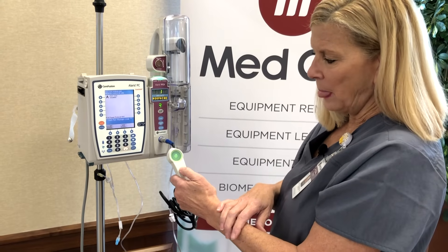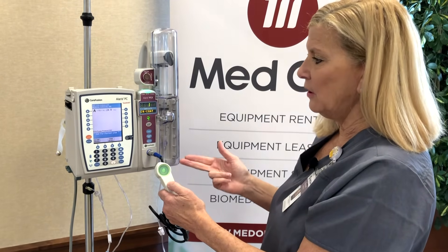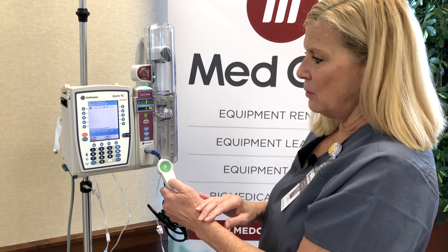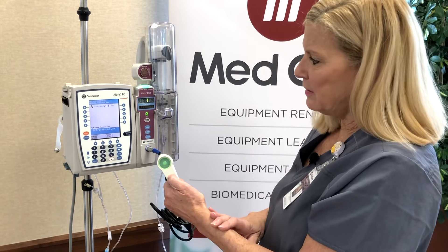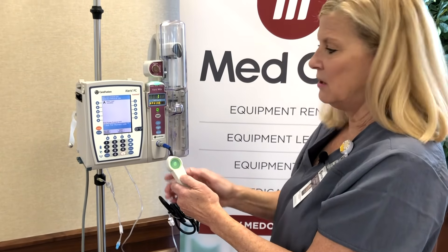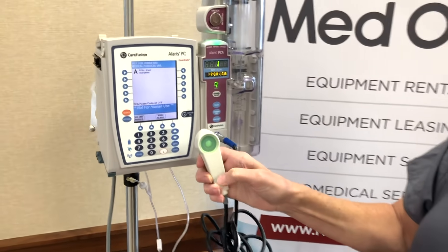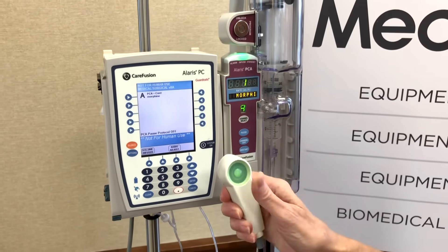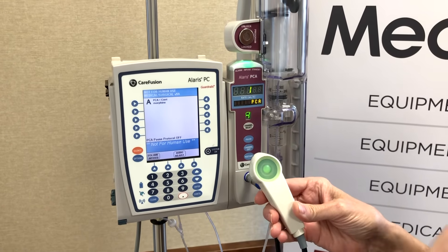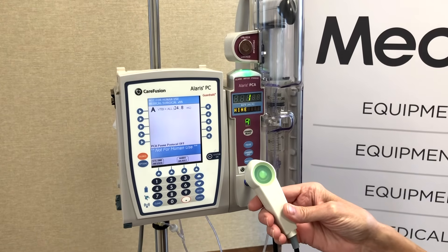Profile two — the light is on all the time, whether a dose is available, whether they're receiving it, or whether they're in their lockout. Profile three is just the opposite — it's off all the time. From a patient compliance standpoint, it's probably better to use profile one, so patients won't be pressing the button all the time. When I press the button during lockout, nothing happens. It should really cut down on the number of attempts a patient makes when they understand that when the light is on, extra medication is available.